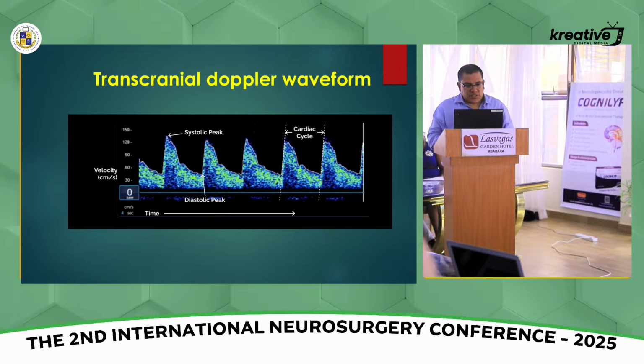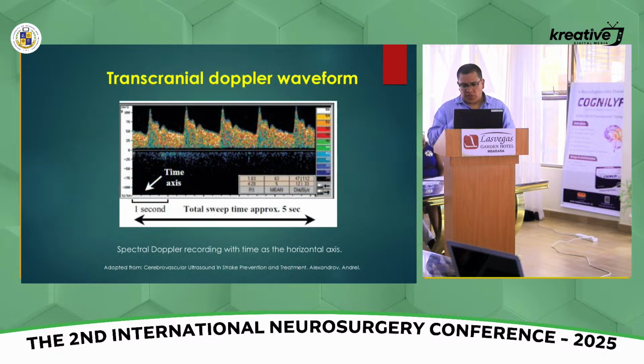This is another example, and that's basically going to tell you the direction of the flow. I don't know if the ultrasound machine here has it, it depends a lot on the software also. I don't know if we'll be able to have the software, but we can work on achieving that as our relationship continues. So basically above that line means that the flow is coming towards you.